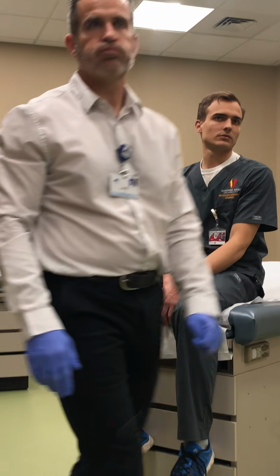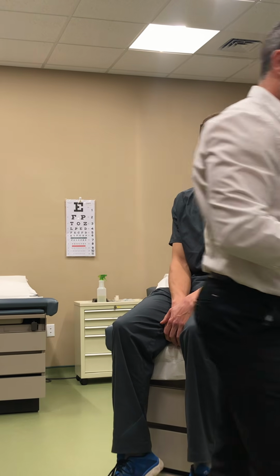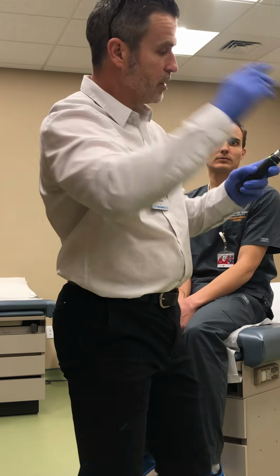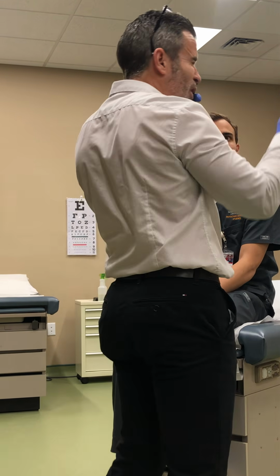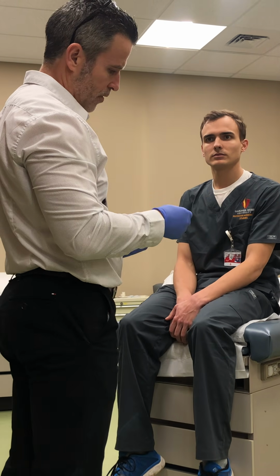Then on to the fundoscopic exam. So fundoscopic exam, we dim both lights, turn this thing on, get my focus. Since we're looking at the back of the eye, we're looking for far away. So I would, you guys can go ahead and cut the light off. And that one. And so I would try to focus on this.